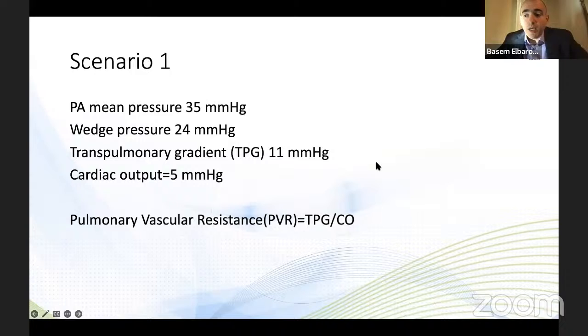Usually the right heart cath is to reassure the heart failure doctor that everything's looking good and the filling pressures are normal. But it's more for the biopsies where it's important. So yeah, heart transplant patients get tons of biopsies done.